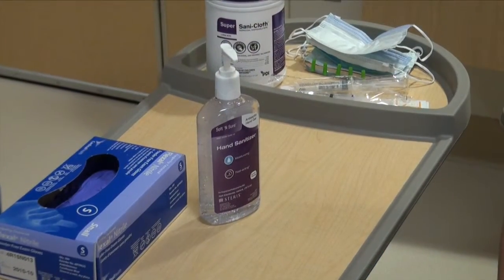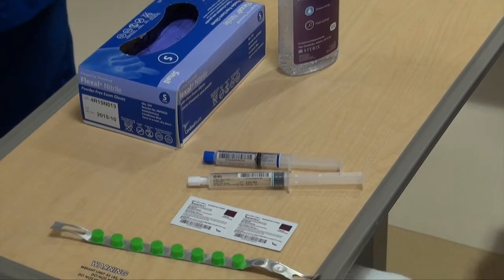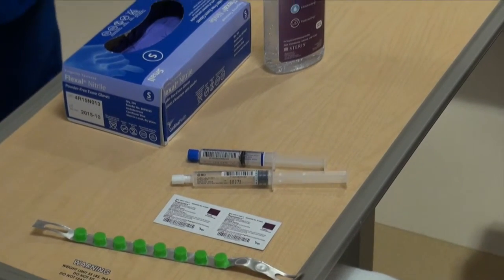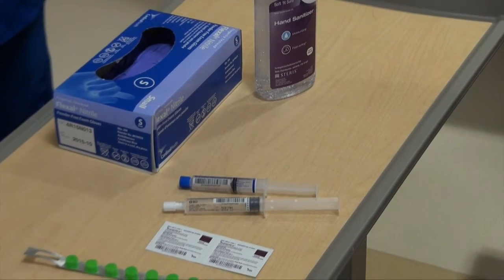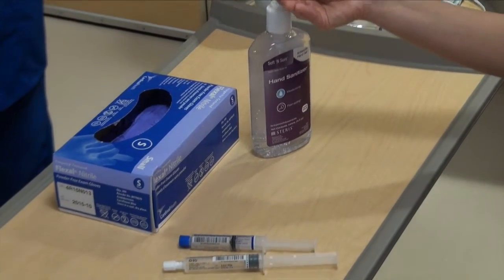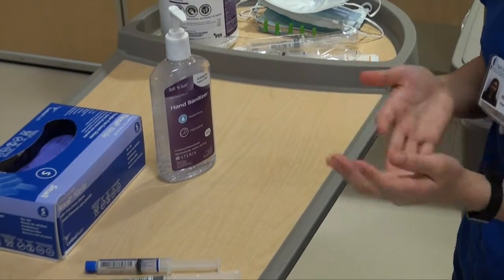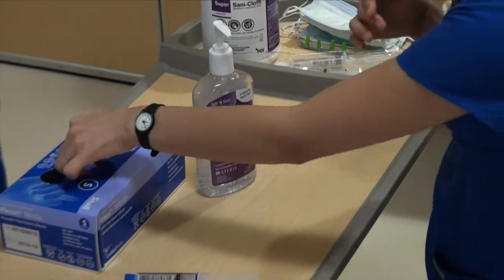Central lines need to be flushed daily when they are not in use. These instructions are similar to what you were given during the intermittent cap change. We will go through the steps now. Set up supplies, including 1 sodium chloride and 1 heparin syringe for each lumen to be flushed, including CHG wipes and Curos caps. Wash your hands with soap and water for at least 30 seconds or hand sanitizer. Allow to dry. Put on clean gloves.